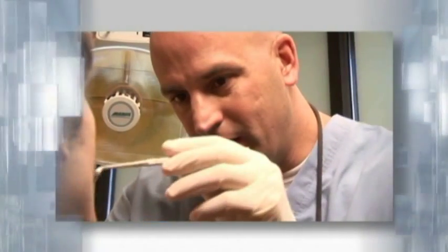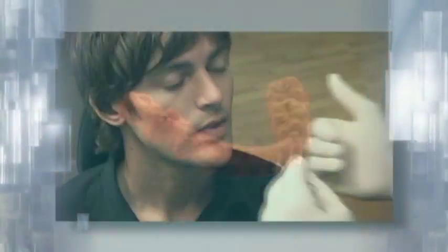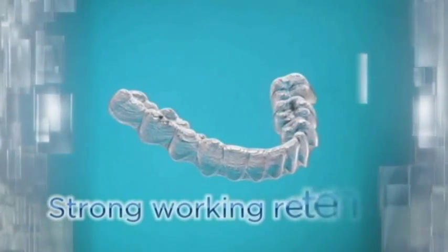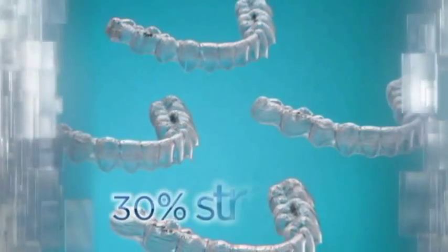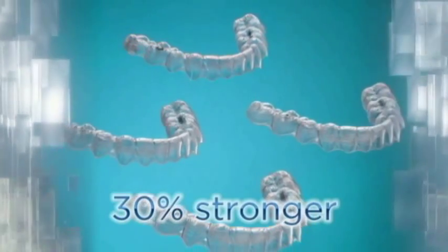Vivera, from the makers of Invisalign, is a clear thermoplastic retainer designed to be used after completing orthodontic treatment. Vivera retainers are suitable for Invisalign and non-Invisalign patients and can be made directly from a final Invisalign treatment stage or from a dental impression. They provide a strong retention solution and are made from a clear thermoplastic material that is up to 30% stronger than the leading materials tested.